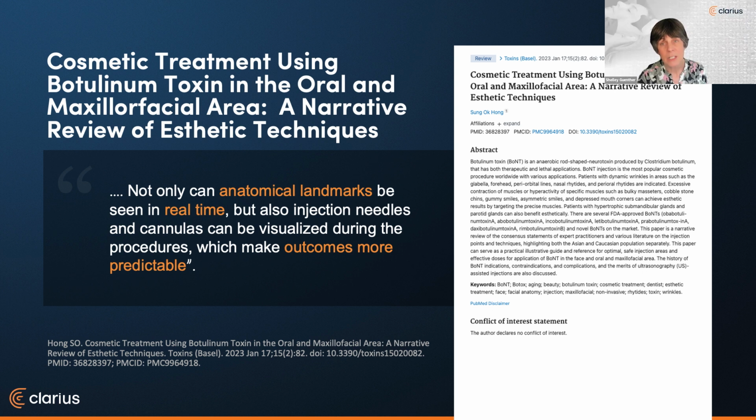While most issues are mild and manageable, serious complications like vascular compromise, infections, and delayed onset nodules can impact aesthetic outcomes and require invasive treatment. This article outlines strategies for prevention and management, including safe injection techniques and ultrasound guidance for vascular mapping, filler assessment, and treatment. Practitioners must understand injection anatomy and how to prevent, recognize, and manage complications effectively.